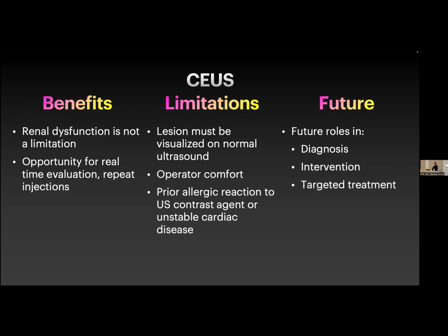So if we're trying to biopsy something and we keep getting non-diagnostic or unclear results, we can maybe use the contrast agent to see what's enhancing, what has the most enhancement, and where we can try to get samples from at that site.